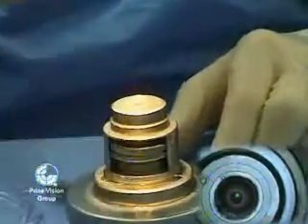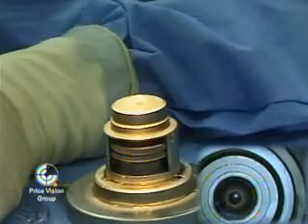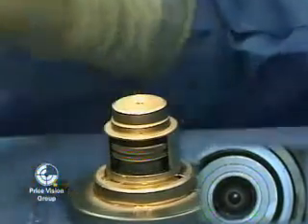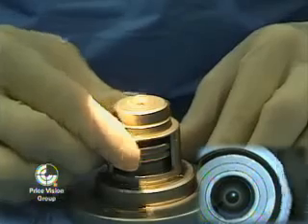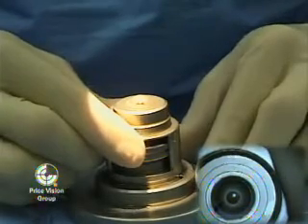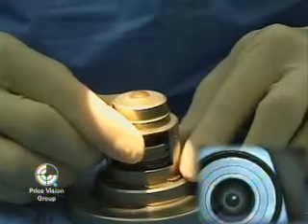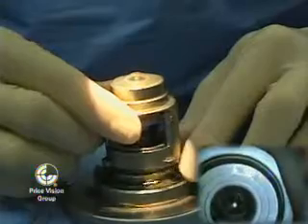Now we've turned the infusion back on at this point so that when we start to disassemble the artificial anterior chamber, we don't want it to collapse and actually create suction that could pull the endothelium back down against metal in the artificial anterior chamber. So you'll see that as we lift this up, there'll be some fluid flow. And then once we get air behind the cornea, we can turn off the infusion.